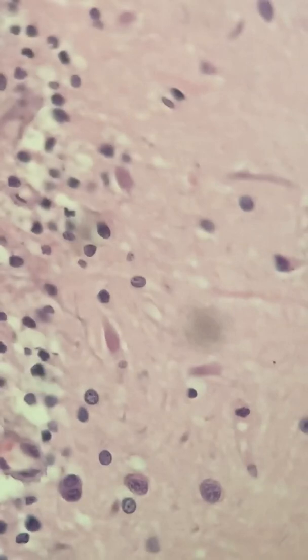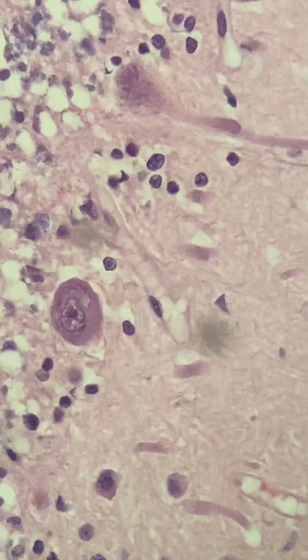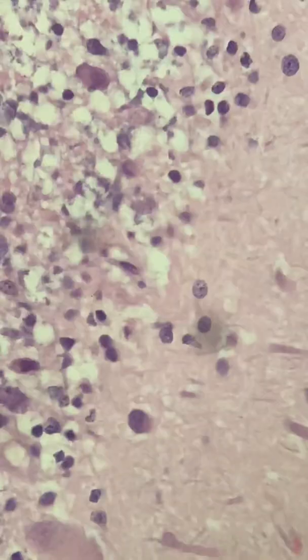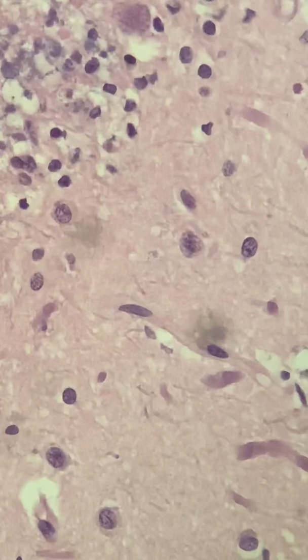There are some red neurons scattered about. So obviously the person did have some hypoxic changes in the brain, but not bad. And there are some edematous changes as well, because he was fluid overloaded from the doctors' standpoint, giving him a ton of fluid. But other than that, the brain doesn't look that bad. Obviously, a few scattered red neurons, but otherwise the neurons look pretty happy.